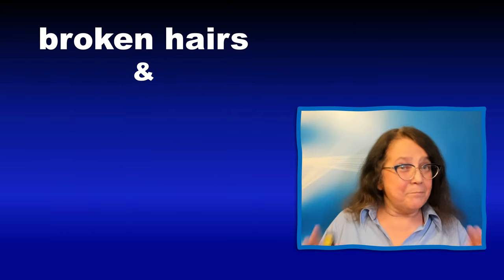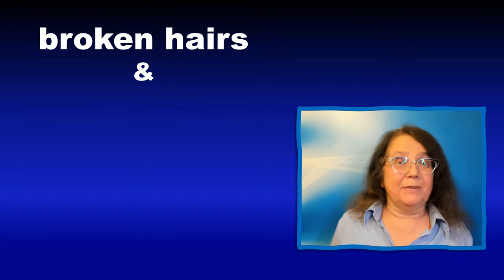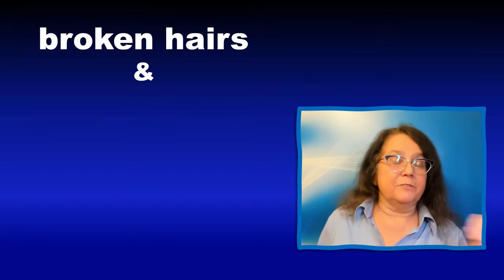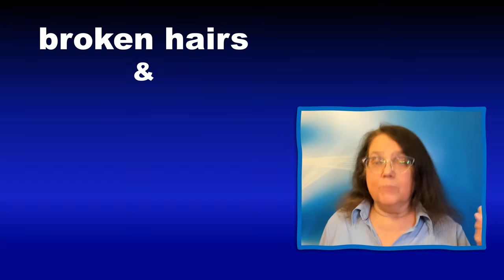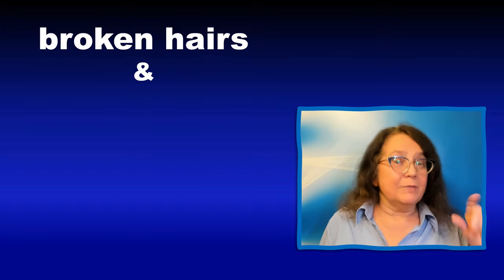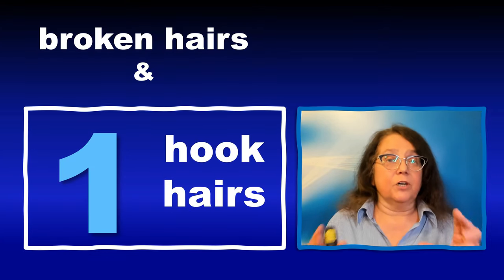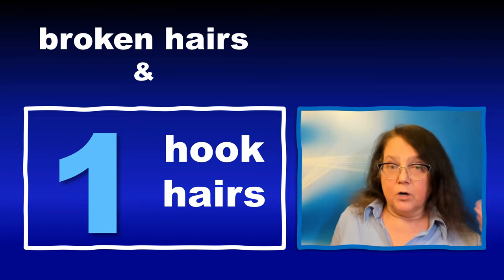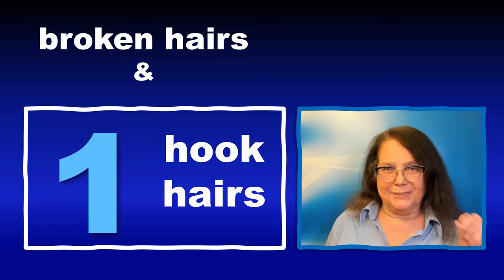In conclusion, multiple broken hairs, especially in a chaotic arrangement, are a very common feature of trichotillomania in trichoscopy. The one most characteristic feature with the highest positive predictive value is the presence of the hook hairs. And if there is more than one in a field of view, you can be almost sure about the diagnosis.